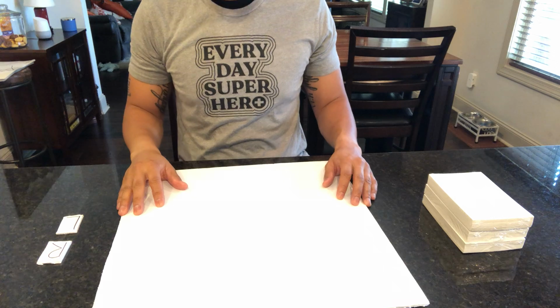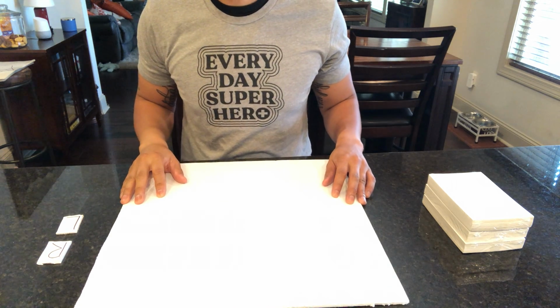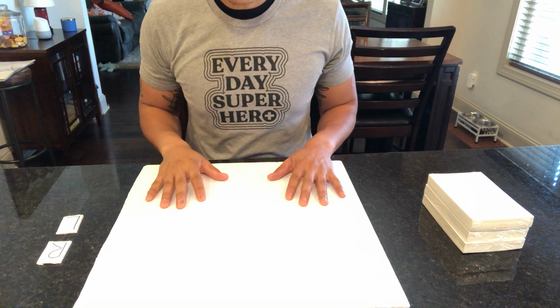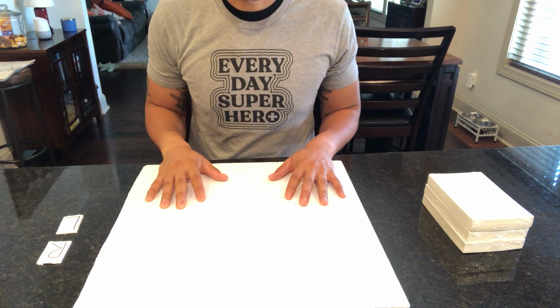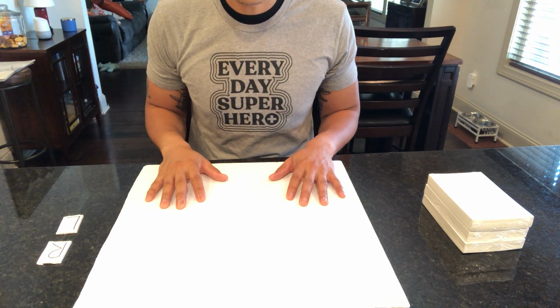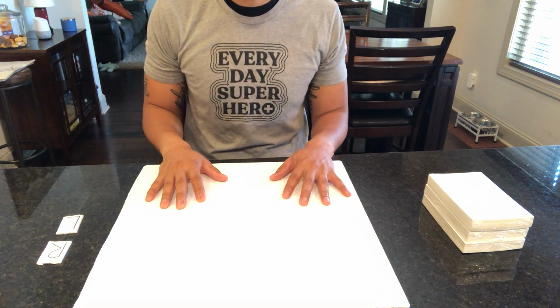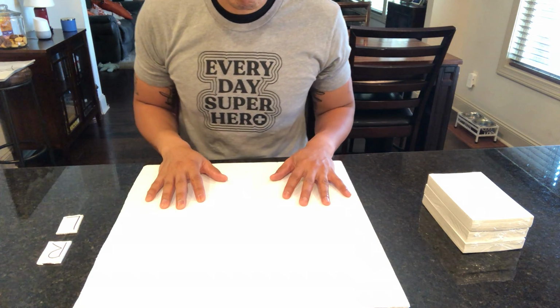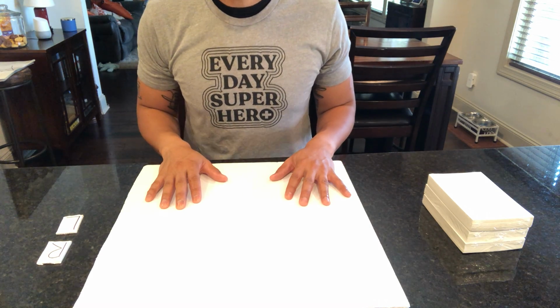This is a 17 by 17 piece of poster board, which I will be simulating as a cassette. Typically for finger and thumb projections, your SID is going to be 40. You're going to use a 12 by 10 cassette. That's just kind of the basics here. So we'll go ahead and get started.